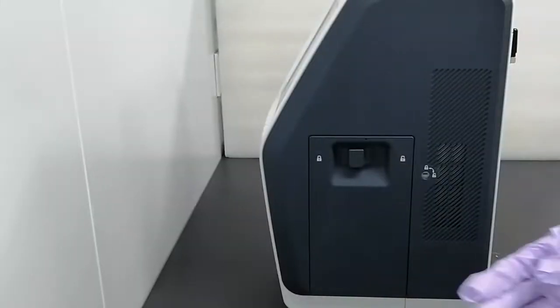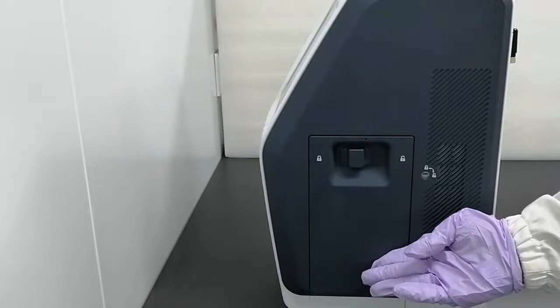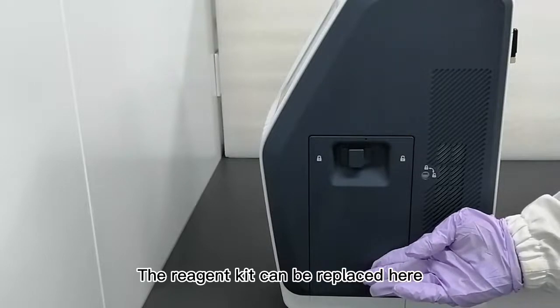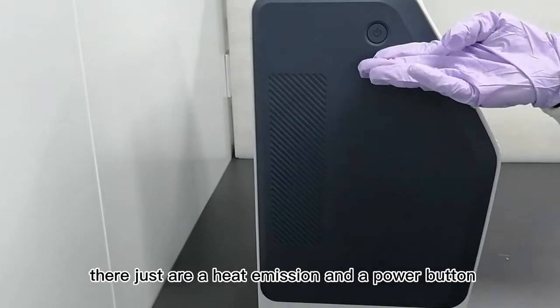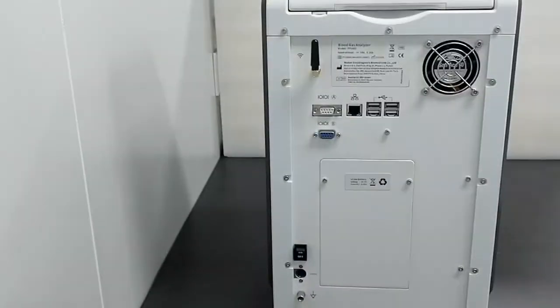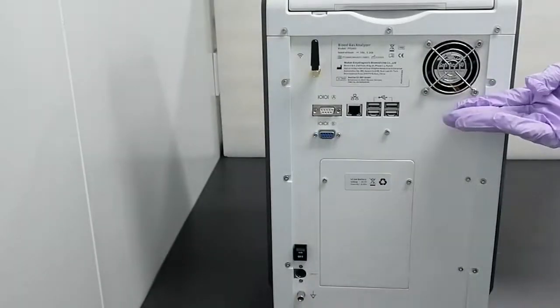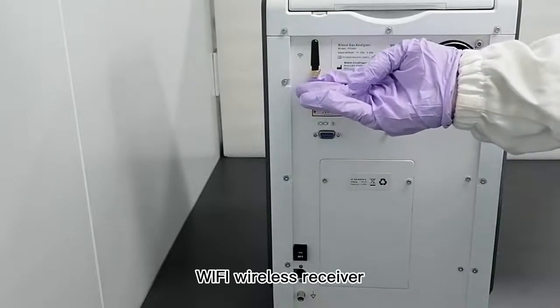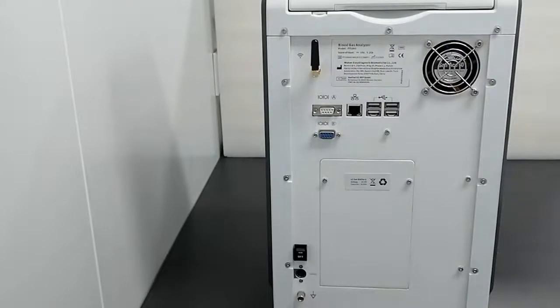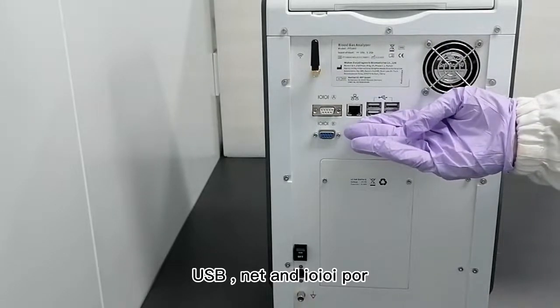On the left panel is the reagent kit chamber door, where the reagent kit can be replaced. On the right panel, there is a heat emission vent and a power button. On the back panel: a fan for emission of mainboard heat, a Wi-Fi wireless receiver.